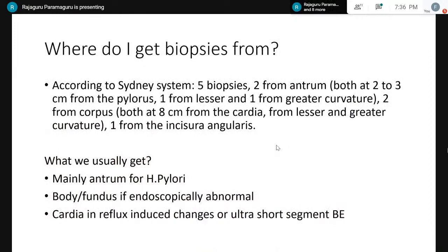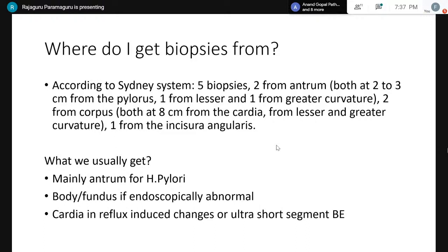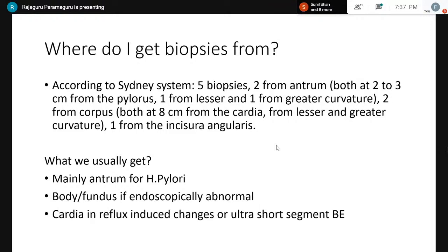According to Sydney's system we need five biopsies: two from the antrum, two from the corpus, and one from the incisura angularis. Usually we get mostly from the antrum, since clinicians are mostly interested in whether H. pylori is present. When they find abnormality in the body, fundus, or elsewhere, they take biopsies from those sites too. Cardiac biopsies are taken less frequently, mainly when dealing with reflux esophagitis or ultra-short segment Barrett's esophagus. The mucinous glands in the cardia will just look like the antrum mucosa — keep that in mind.